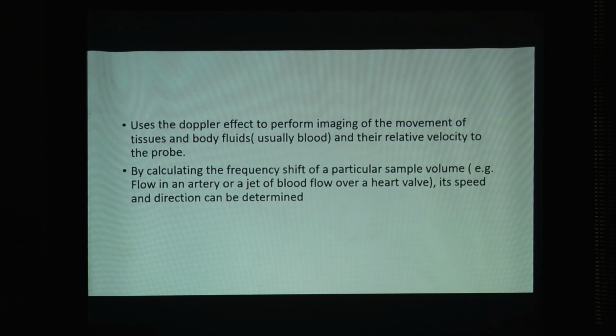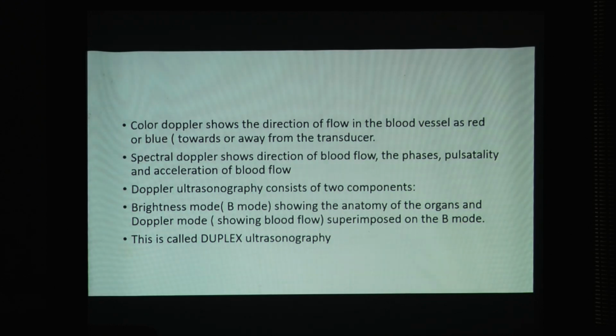See, any movement produces color, so the ureters draining into the bladder will produce color. And also the fetus, if you observe, when it moves and all, you get the color images. But usually Doppler is made use of for determining the velocity in the vessels, their block, etc. So the color Doppler shows the direction of flow.